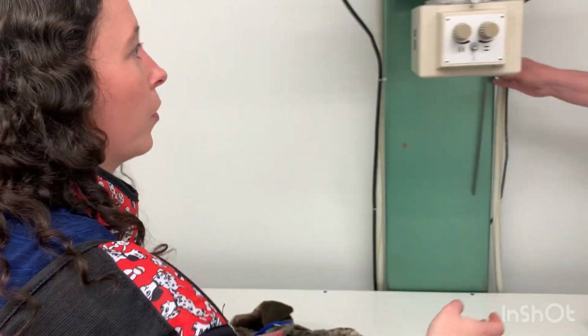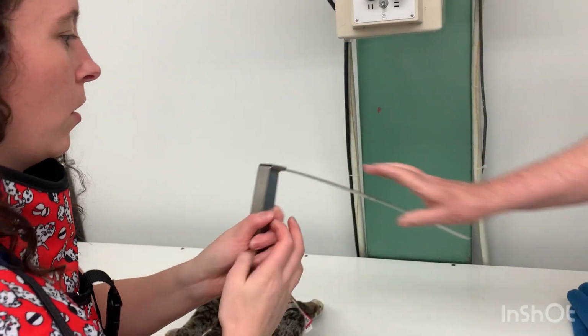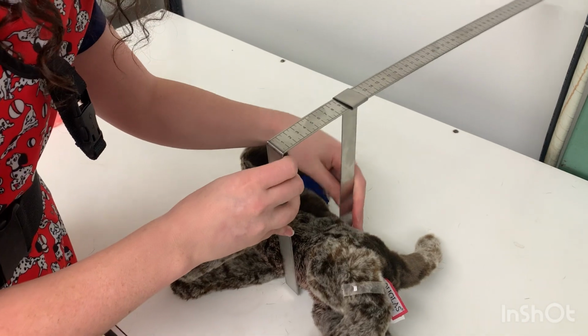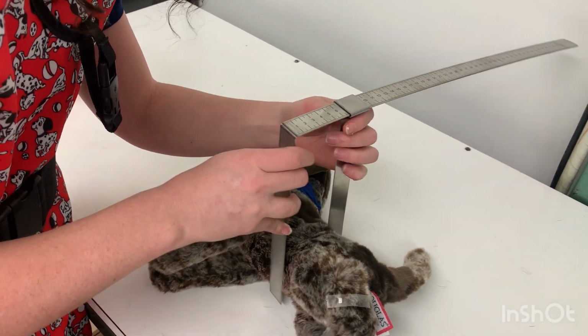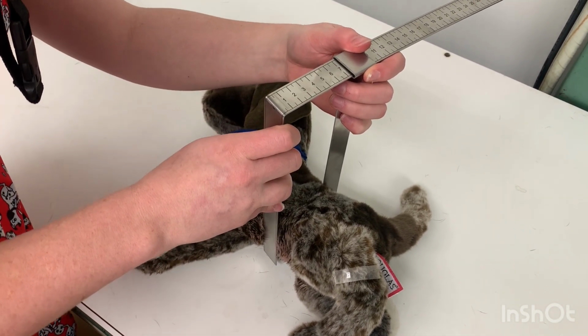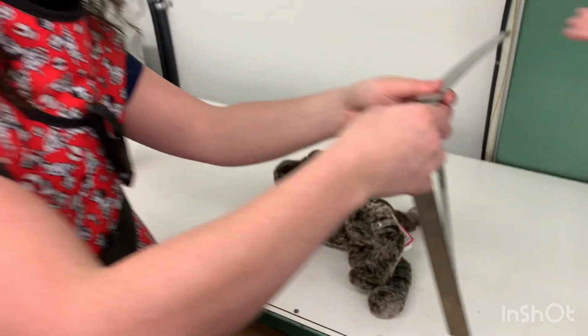While that is processing, we can measure our animal here. I'll ask my assistant to hand me the calipers, please. Thank you. Calipers, yes, thank you. So, just taking a measurement of the widest aspect of our abdomen, you're going to see here, it's going to be just over about 7.5. So I'll hand this back to you.